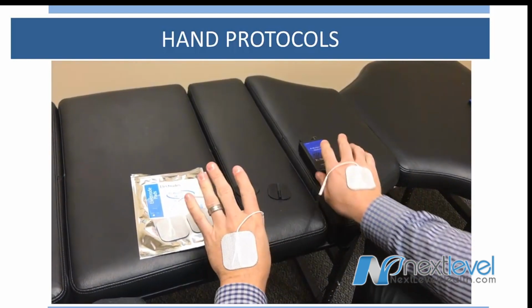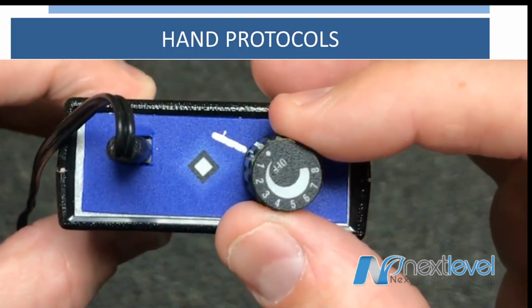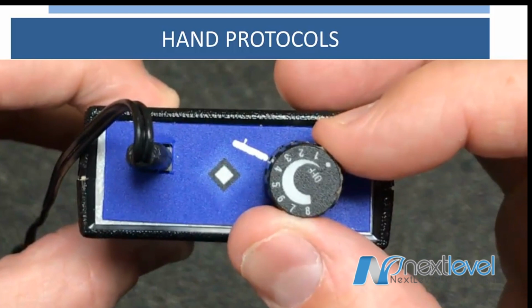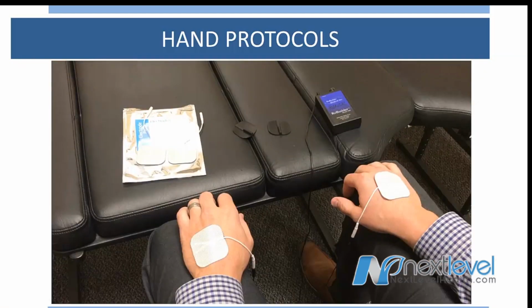Slowly turn the knob to the right. As it starts to flash green, it's on. You're going to want to go between a 3 and a 4 to start. If you feel it, it should be mild at the most, and you may not feel it based on your condition. After 15 minutes, when your timer goes off, you're going to want to turn the Rebuilder to the off position so it's no longer flashing.